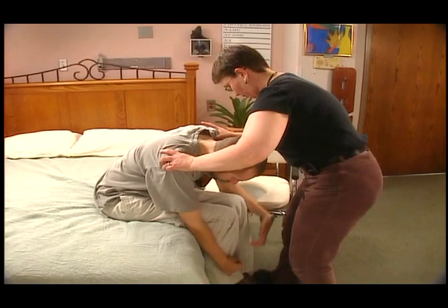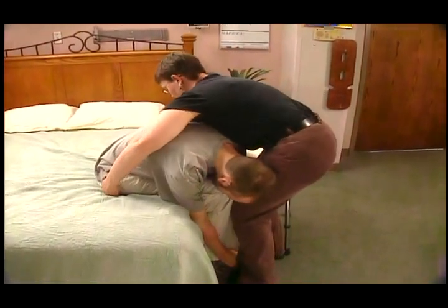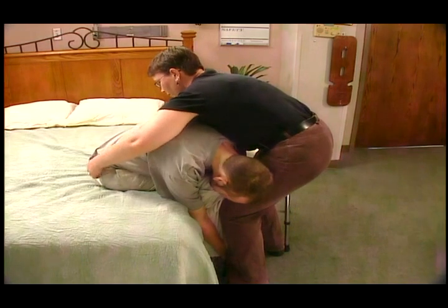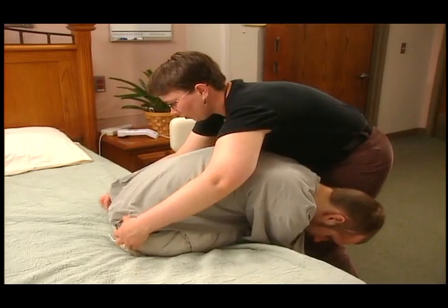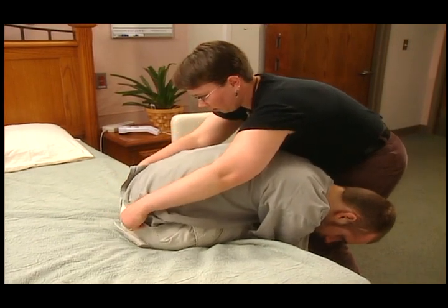The dependent transfer is used for a patient who cannot assist in the transfer and therefore requires complete assistance to move to various surfaces. In this dependent transfer from bed to wheelchair, the therapist stands in front of the patient. The first step is to position the patient's trunk in forward flexion so that the chest is lying on the thighs. Here the therapist is holding on to the waistline of the patient's pants for support during the transfer.